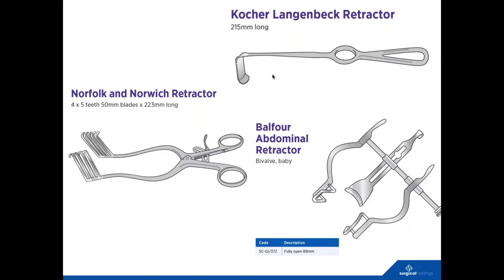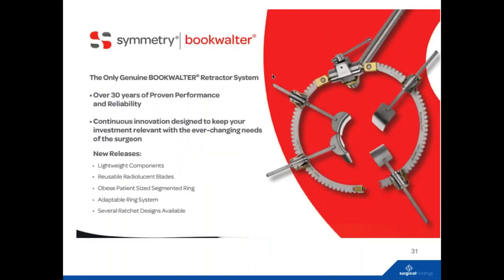Again, something to point out on those is where they are used in cardiovascular, quite often they'll be used with saline for longer periods of surgery. So it's really important to check those devices after they've been used, because obviously they're going to be in use longer. The blood that's on them can cause damage. And of course there are other more complicated retractor systems as well.